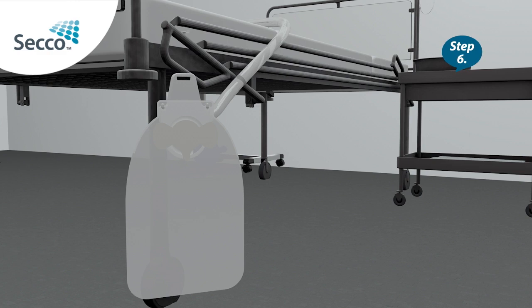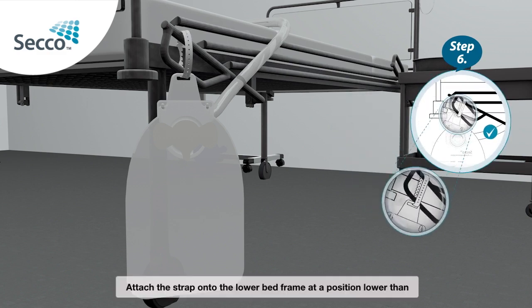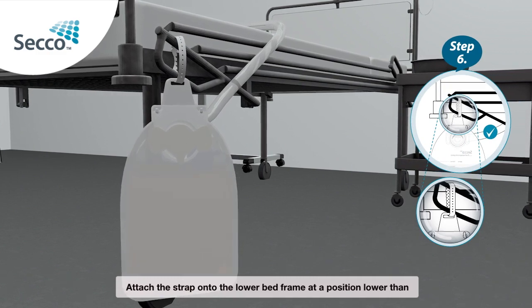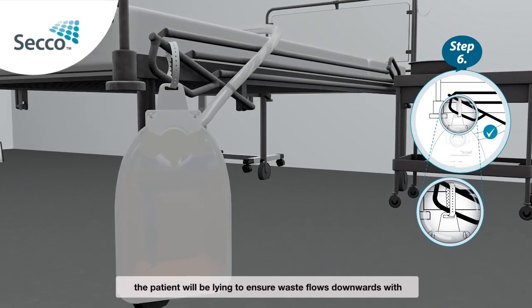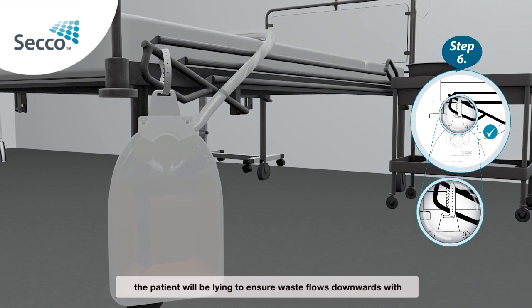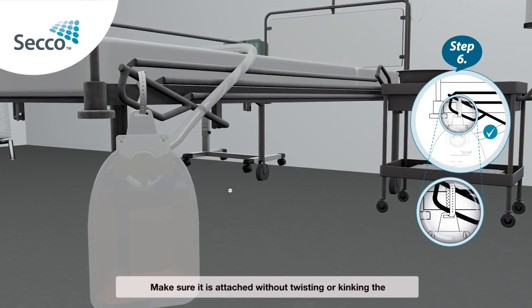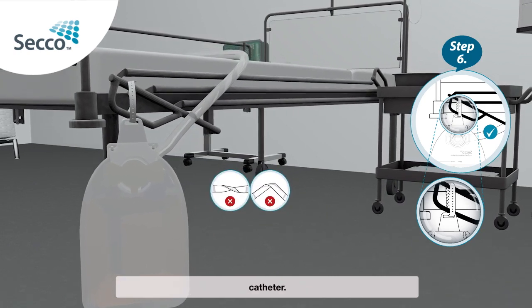Step 6: Recheck that the hooks are still securely in the eyelet and the connection is secure. Attach the strap onto the lower bed frame at a position lower than the patient will be lying, to ensure waste flows downwards with gravity. Make sure it is attached without twisting or kinking the catheter.